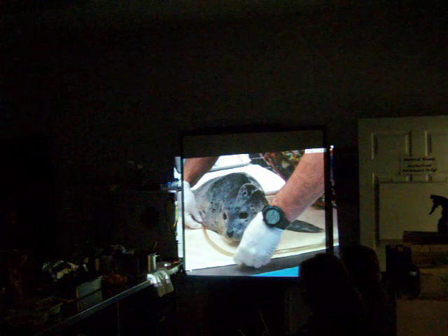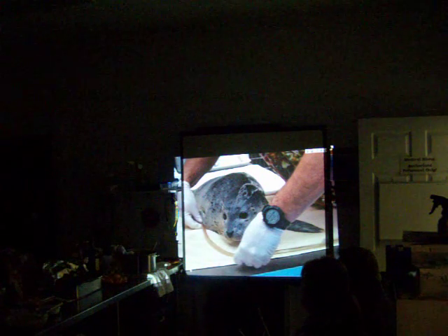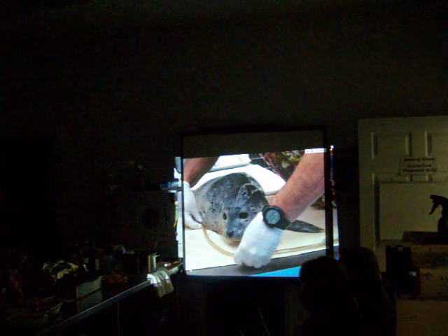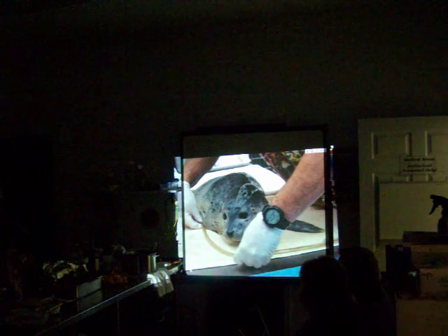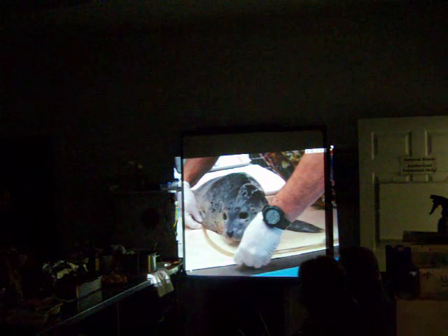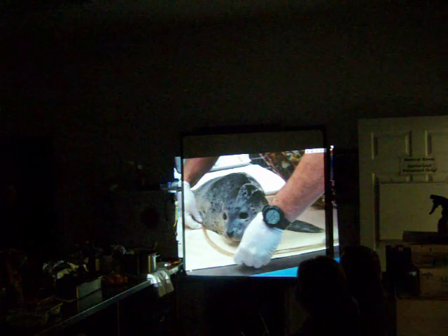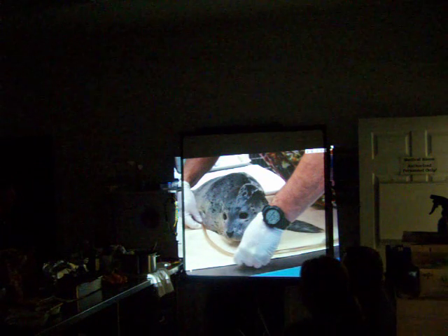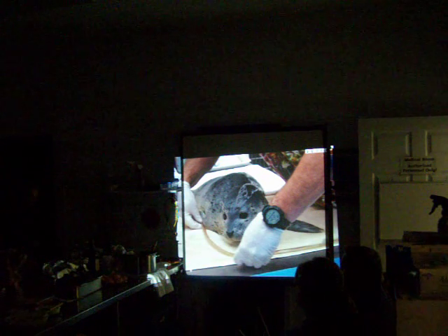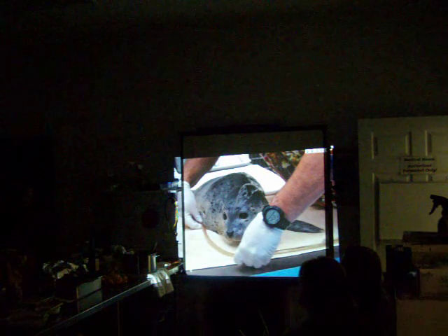So that slide right there is when you're doing a feed on any animal, you need to measure the tube to be able to figure out where the stomach is. The way it's done is we'll have the harbor seal pup on this table on a towel. You try to flatten them out a little bit, and depending on the animal, that can be very easy or extremely difficult, and they're all very different. But the idea is that you want to take the tube and hold it from the tip of the nose to the end of the side flipper, and all the way to the end.